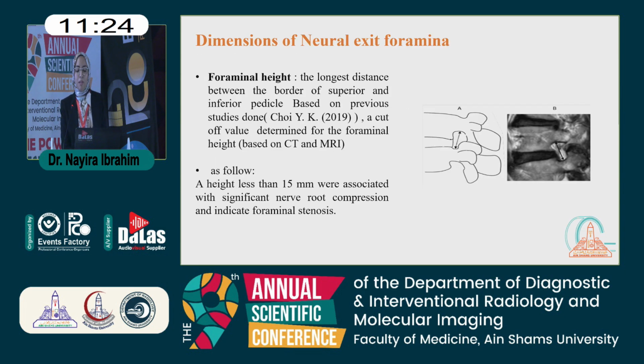Foraminal height and foraminal area were also measured, searching for any significant positional narrowing. Foraminal height was measured as the longest distance between the border of the superior and inferior pedicle. Based on previous studies, a height less than 15 mm was associated with significant nerve root compression and indicates foraminal stenosis.